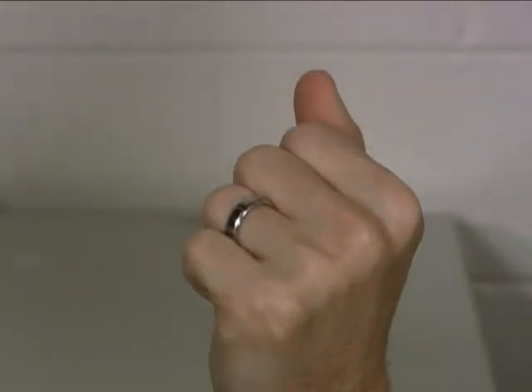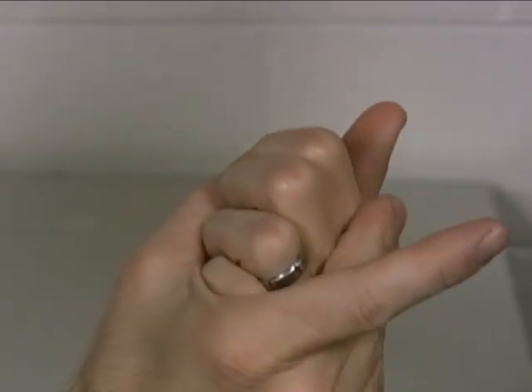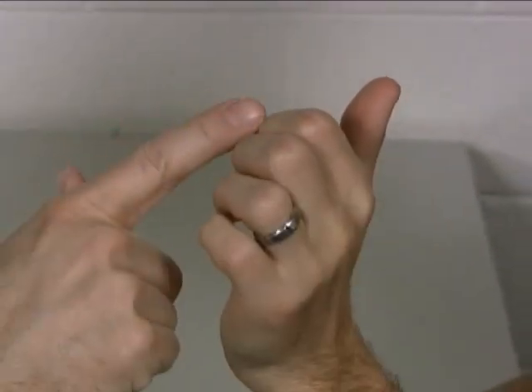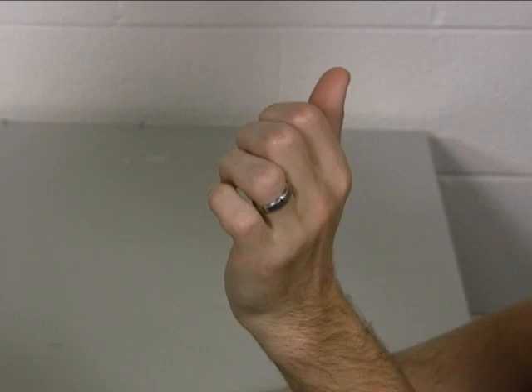The difficulty, though, with the American Medical Association method of using a hook fist is that any intrinsic tightness will limit DIP flexion there. So you'd be measuring the passive insufficiency of the intrinsics rather than the actual joint motion.